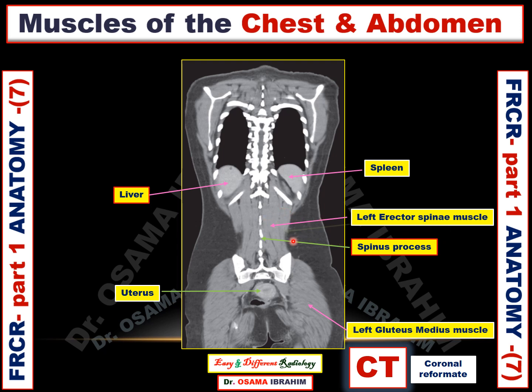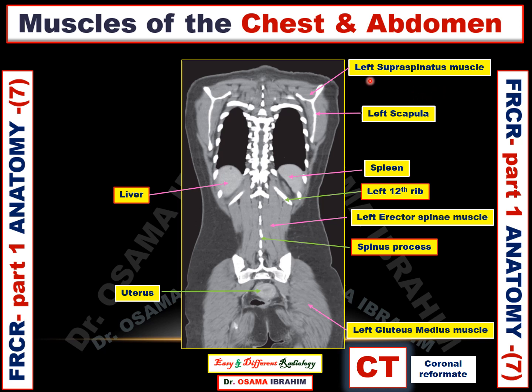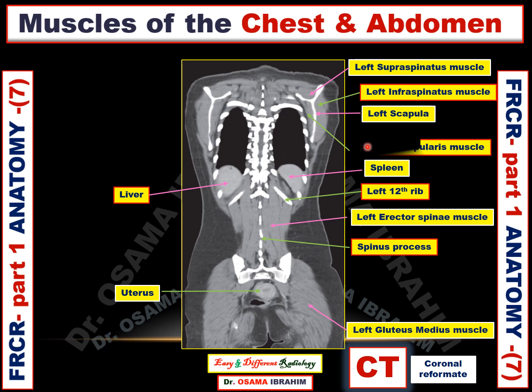This arrow refers to the erector spinae muscle. This arrow refers to the last rib on the left side, the left twelfth rib. This arrow refers to the scapula, and there are some muscles surrounding the scapula. This arrow refers to the left supraspinatus muscle, and the outer muscle on the scapular surface is the left infraspinatus muscle. The most internal one just adjacent to the scapular surface is the subscapularis muscle on the left side.